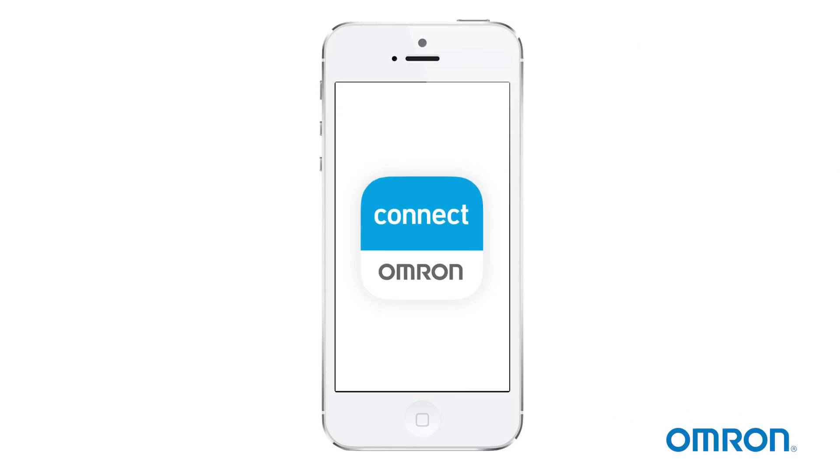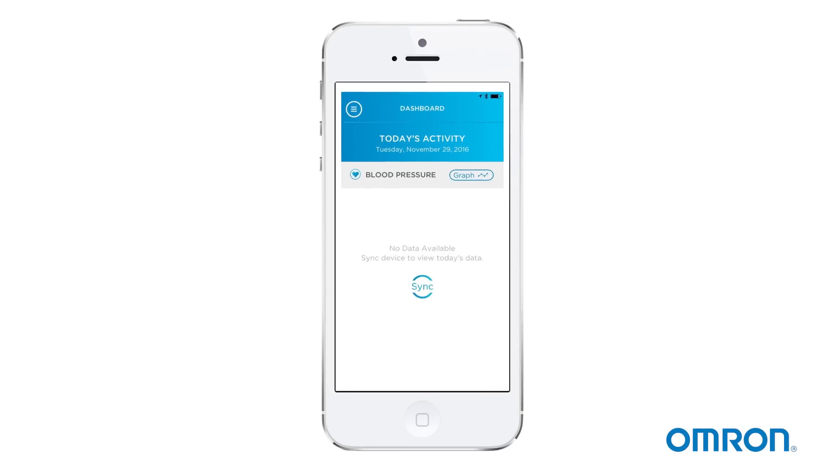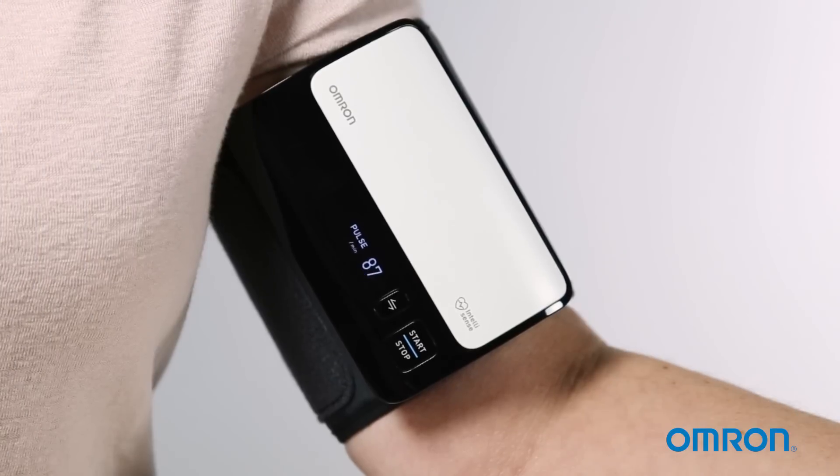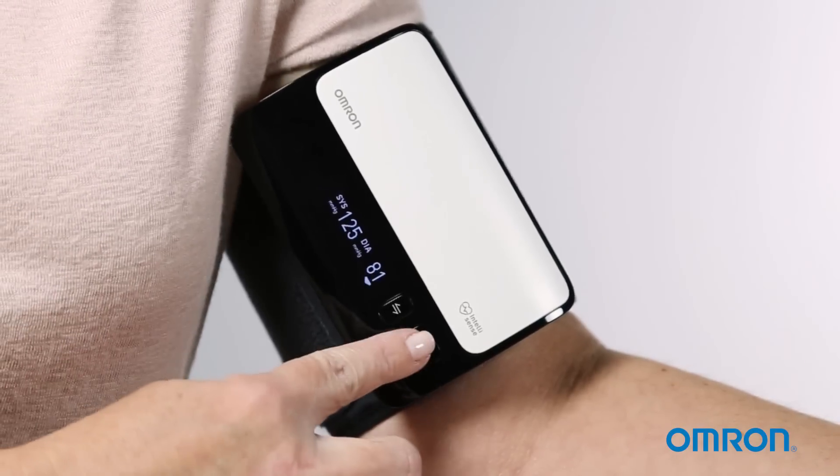Make sure to record your readings or transfer them to the app. To start the transfer, open the app and tap the sync button. When you're done, press the start/stop button to turn off your monitor.